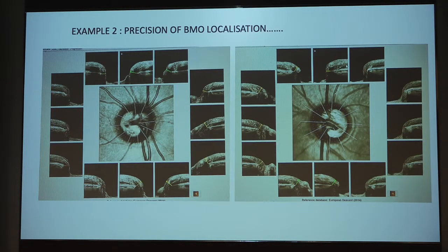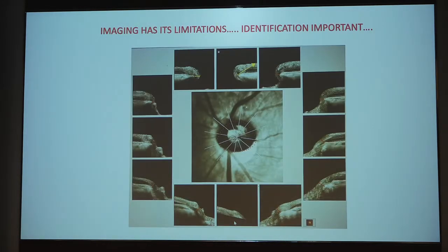If you can see in this image also, you have BMO localization that is precise. In every sector of the 12, you can see the BMO and its ending precisely and very clearly, even clear to the normal human eye. And all the sectors are classified depending upon normality in terms of red, green and yellow color coding. Very simple, very easy, but mandatory.